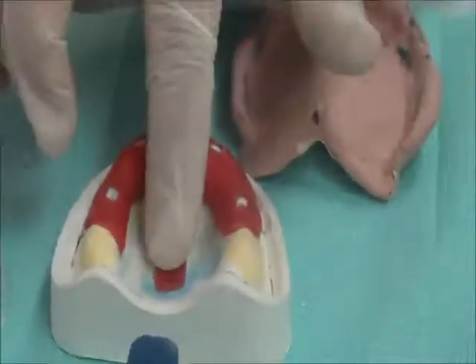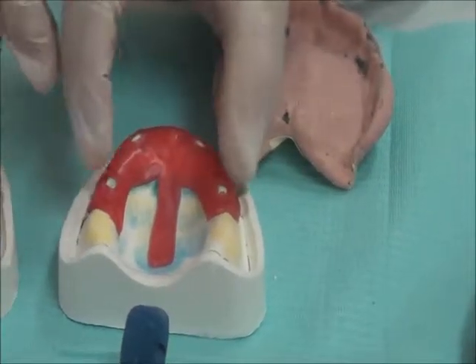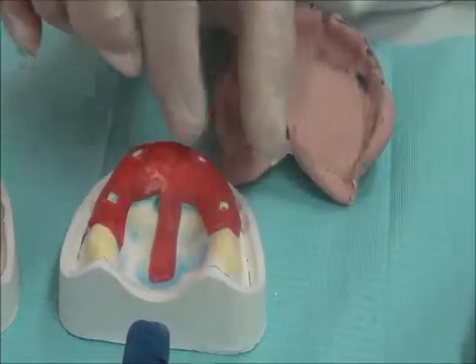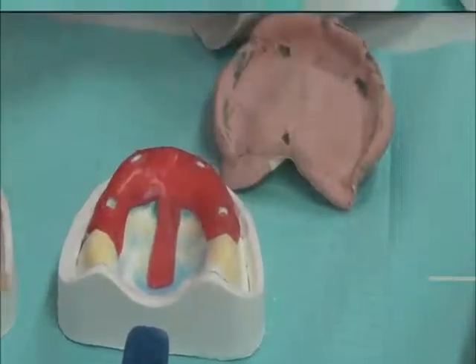In the areas where there is a spacer, the impression material will have space for it to set. It will not be squeezed firmly between the tray and the tissue, so we will have a mucostatic state of the impression material. So in these areas, we do not have pressure on the tissue.